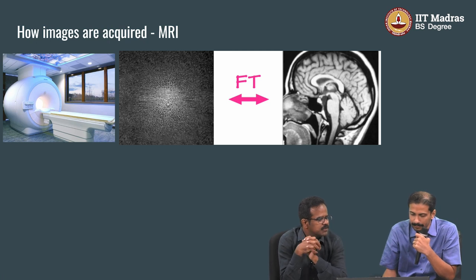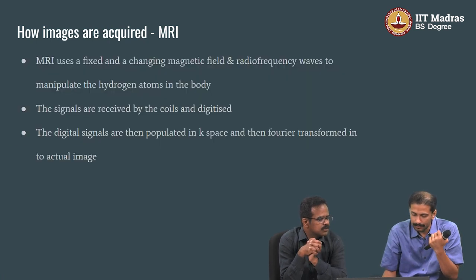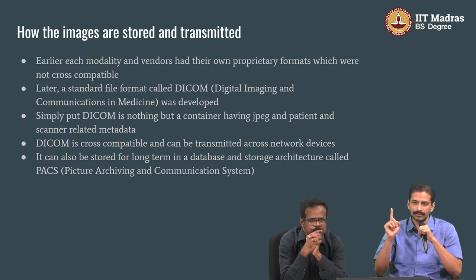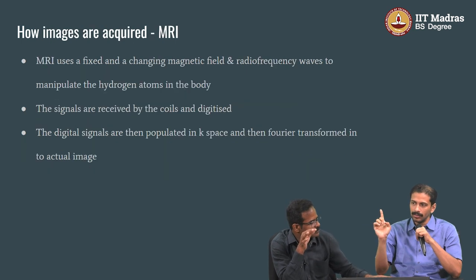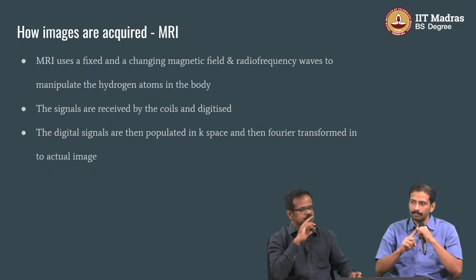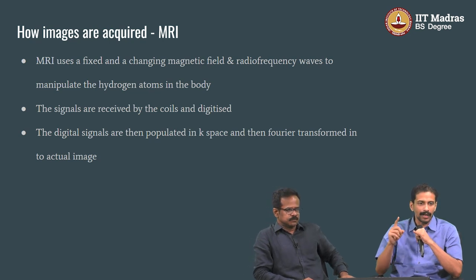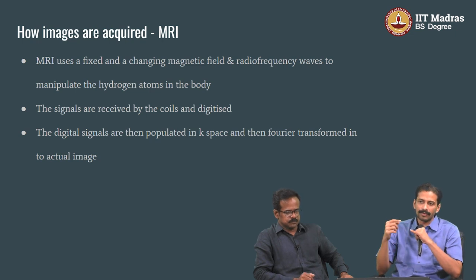So, Deva, what is the benefit of MRI compared to CT scan? So, the first and foremost thing is radiation. There is no radiation involved in MR at all. So, that's a key issue. Especially for children, we use more of MRI because radiation is much more harmful in children. So, that's where we prefer MR.